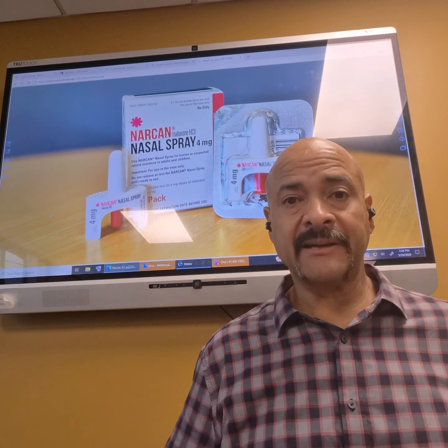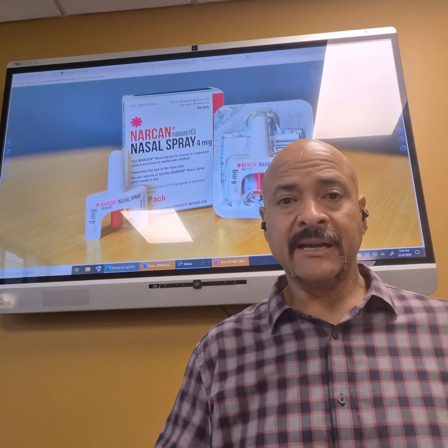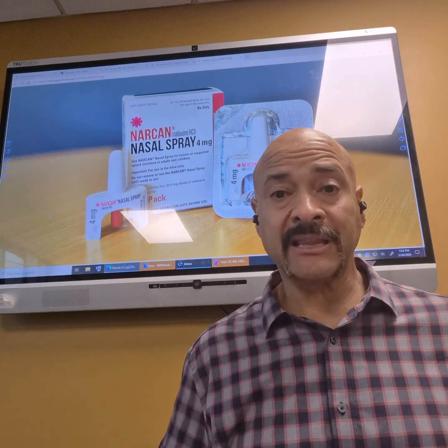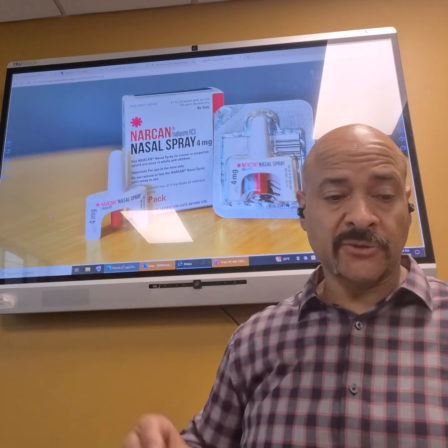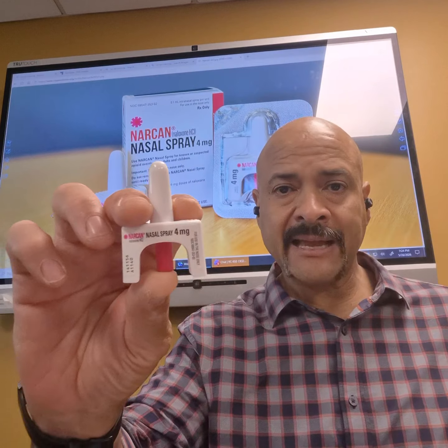Narcan or naloxone reverses the effects of opioid overdose. So this is Narcan. This is 4 milligrams of Narcan or naloxone. You can see on the screen, this is what it looks like. This is what it actually looks like in person.